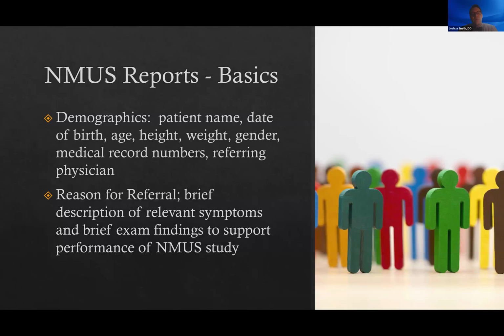One workaround, if you have orders that your physicians send to you, or you have a centralized ordering system, is to include in your EMG and nerve conduction study order a little box that says addition of neuromuscular ultrasound at discretion of testing physician, and then leave it always checked, and they can just uncheck it if they don't want that. I don't know what doctor would not want that information if you think you need it. But that's something you could have in your orders that come from the physicians that maybe makes that a little easier.